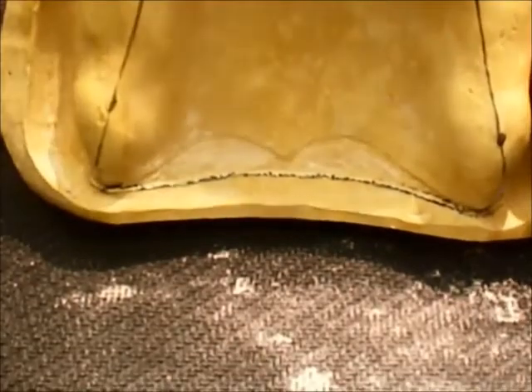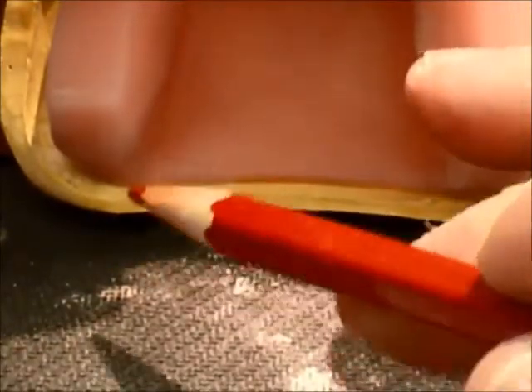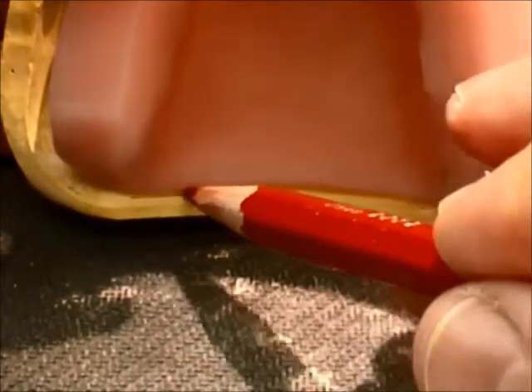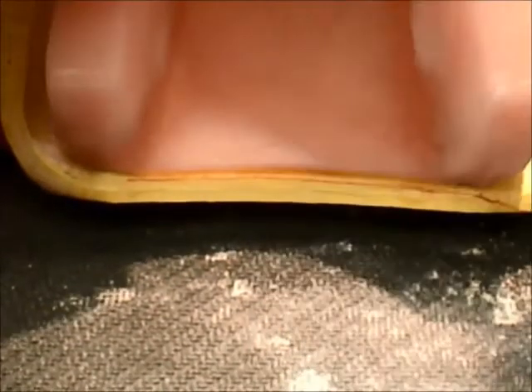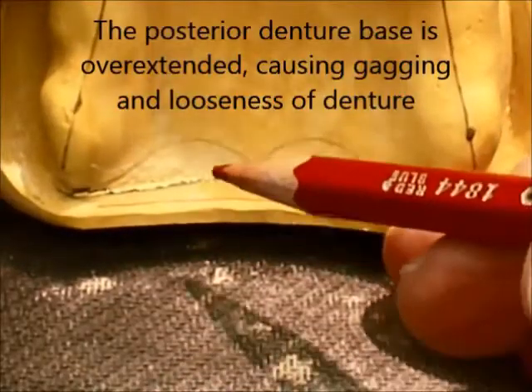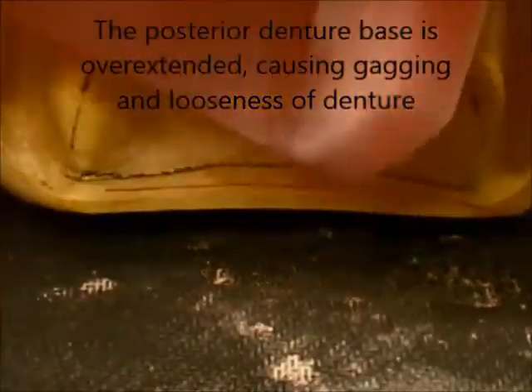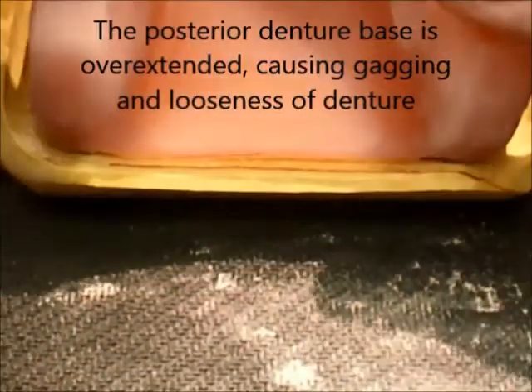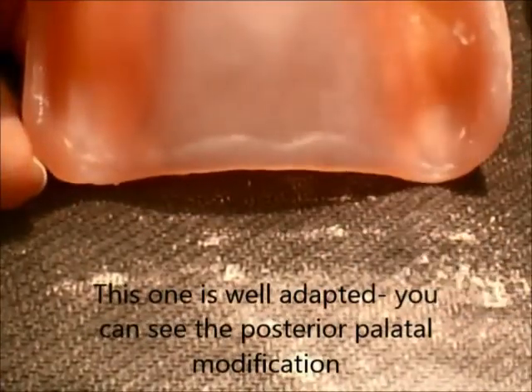This is what it looks like with the posterior border marked, and the occlusion rim is manufactured on this. The record base in the posterior area has been overextended, which will cause a potential for gagging and looseness. You can see the overextension in the rim itself.